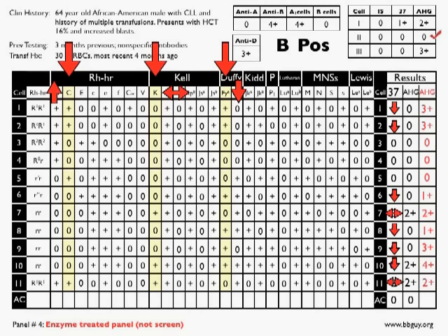So basically what we can say right now is that we have some antigenic activity that decreased, or some antibody activity that decreased. We presume that the antigenic activity decreased. And we have some that stayed exactly the same. So that really tells you that this probably is not anti-big C. And in addition, I'll call your attention to cell 5. Notice that there's a single dose expression of big C on cell 5, which after enzymes did not show up. Commonly, you'll see that kind of a thing where you have a dosed anti-big C, for example, that once you do enzymes and that enhances the activity of the antigen, you actually will see a reaction where there wasn't one before. All those argue in the direction of saying that this is not anti-big C, and in fact that it's more likely a combination of anti-big K and anti-Duffy A.